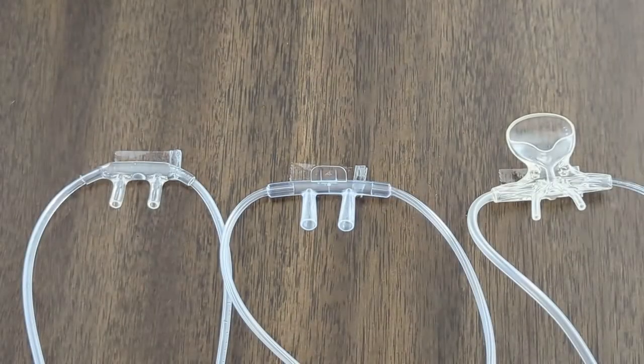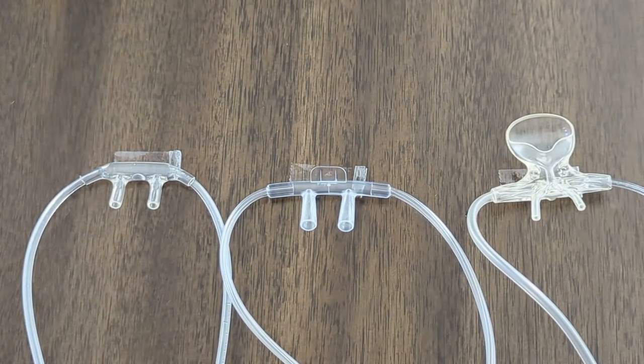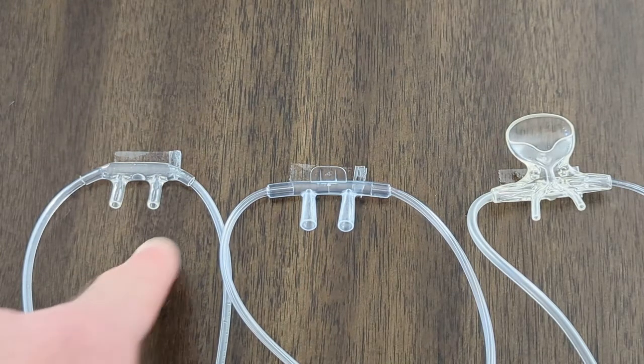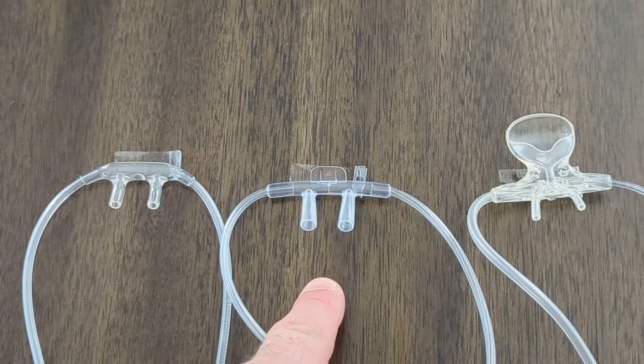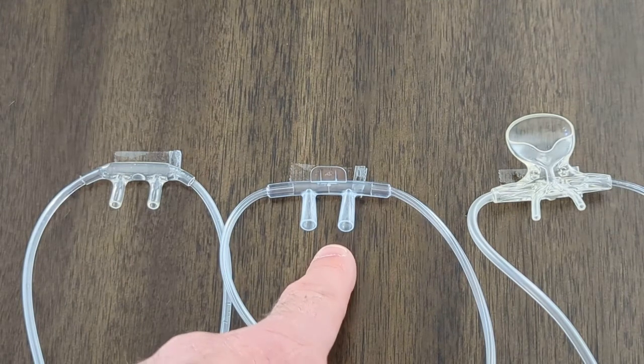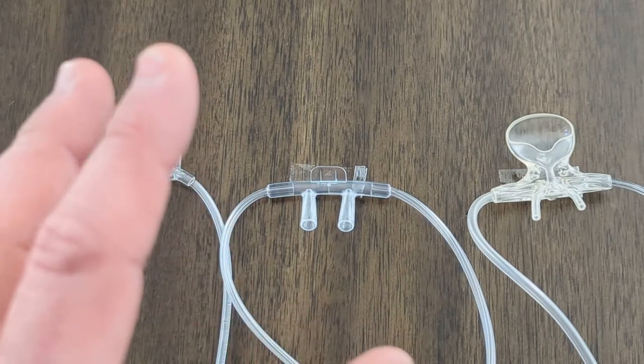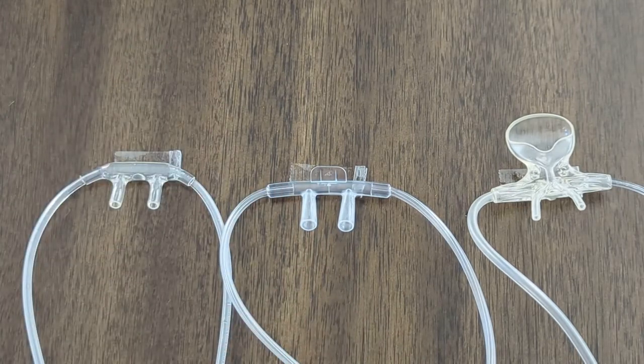This video will review the variants and types of nasal cannulas. On the left is a straight prong nasal cannula. The center is a straight prong flared nasal cannula. The flaring at the ends, instead of having a steady straight stream of oxygen, will disperse it, making it more comfortable for the patient.